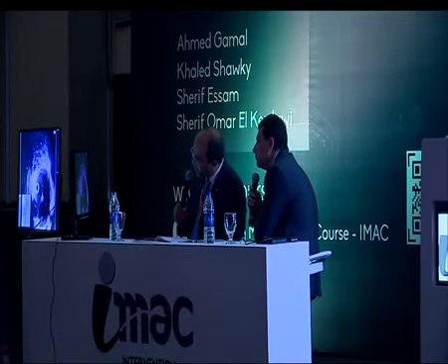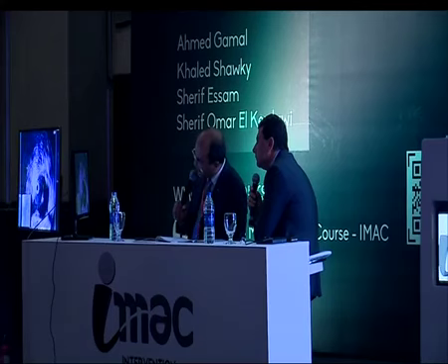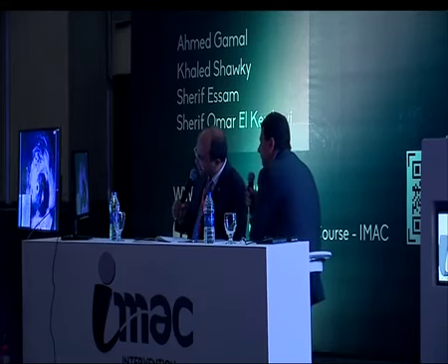Will you please rotate the IVUS catheter so that we can see? Yeah, is this the celiac trunk that we see now? Is this the celiac trunk? Yes, it is. This is the celiac trunk that we see at 7 o'clock, right?